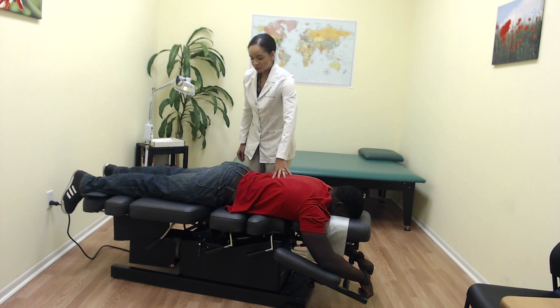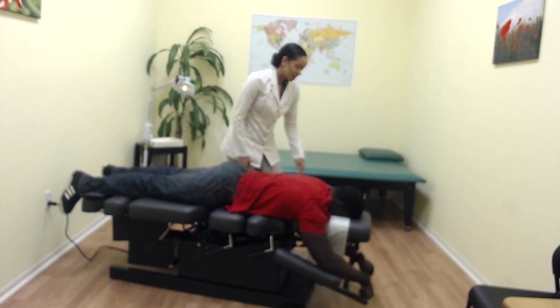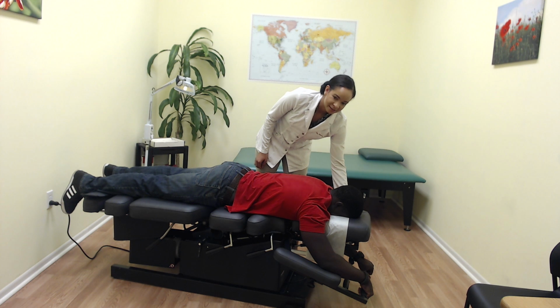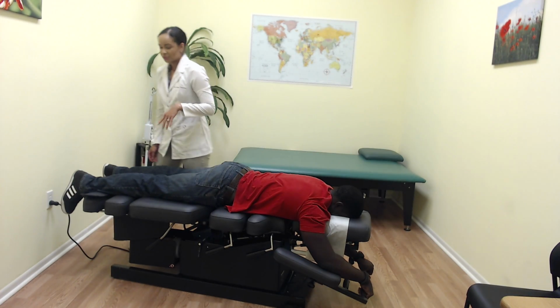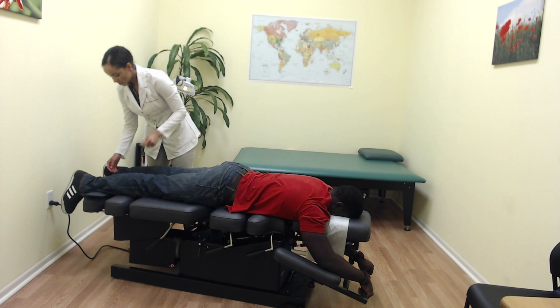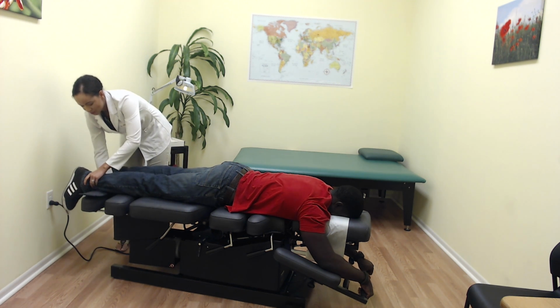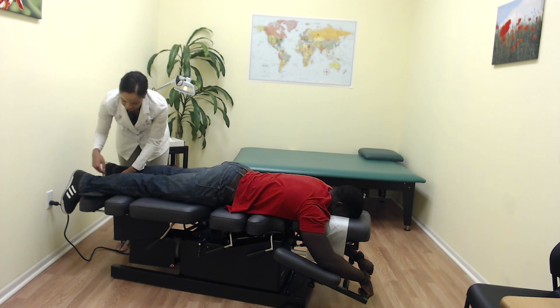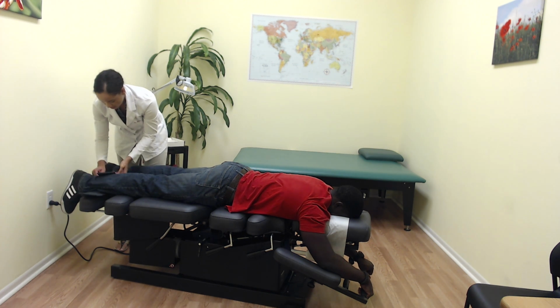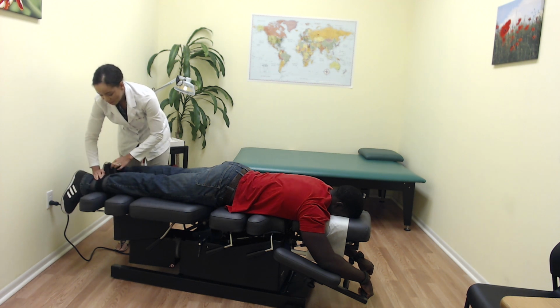So what we're going to do, first thing, he's already face down, so step one's complete. I'm going to unlock the headpiece so that it slides back and forth as the table's moving up and down. It just helps to make the patient more comfortable. Then I'm going to adjust the end of the table. He's a little bit taller, so we want to make sure that the end of the table is right alongside his ankles. Then we're going to go ahead and strap him in.